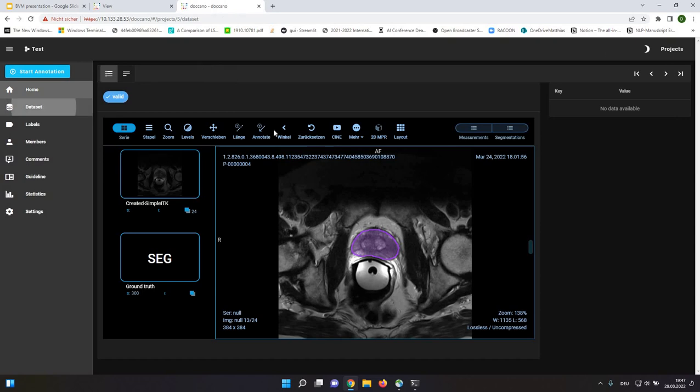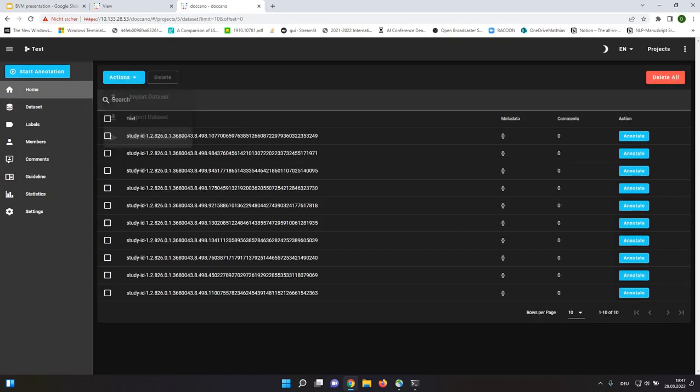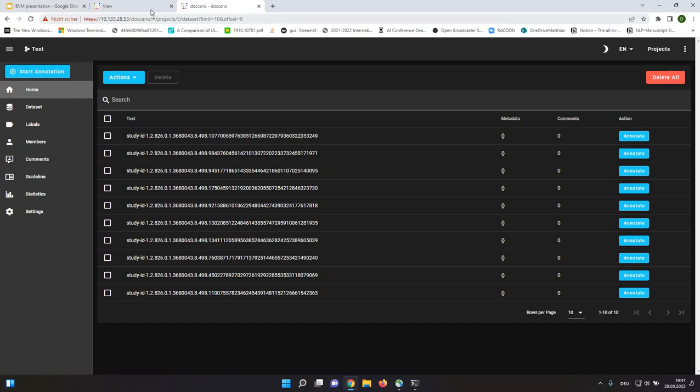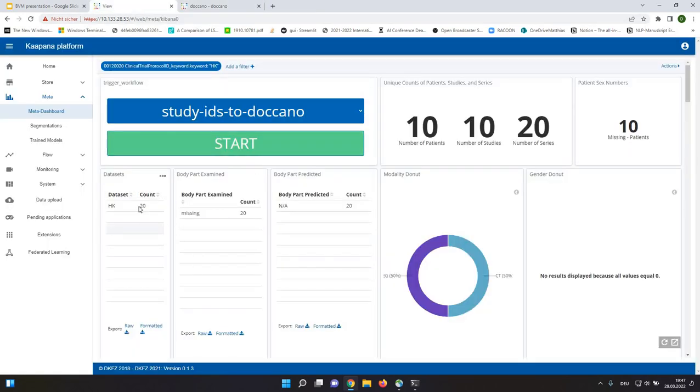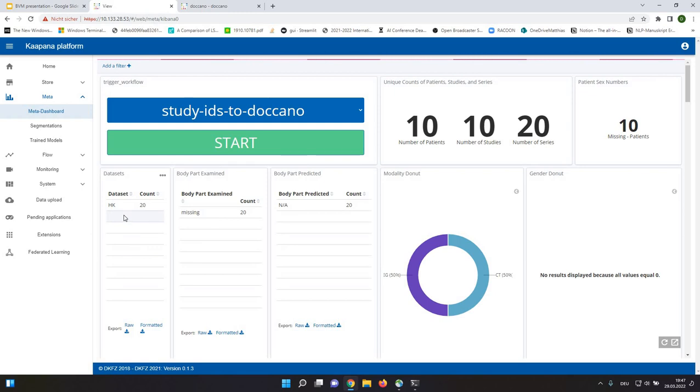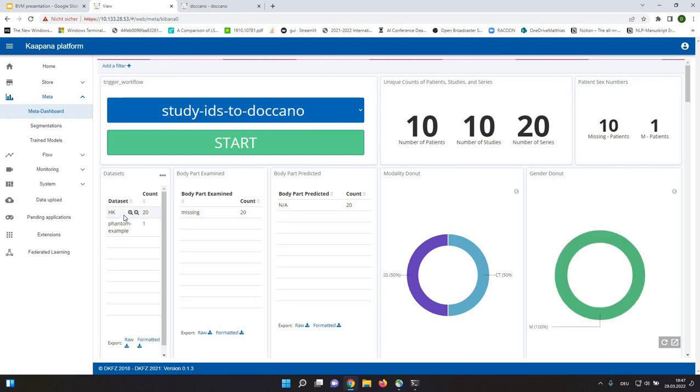And once I'm finished, there's a button called Send Data to Kaapana. And what this one does is that it triggers another pipeline in the background, which will write this tag into the DICOM image. So that at a later point, I can select here my dataset directly via this valid AI title. So that I'm sure that I have good data for my deep learning downstream task.